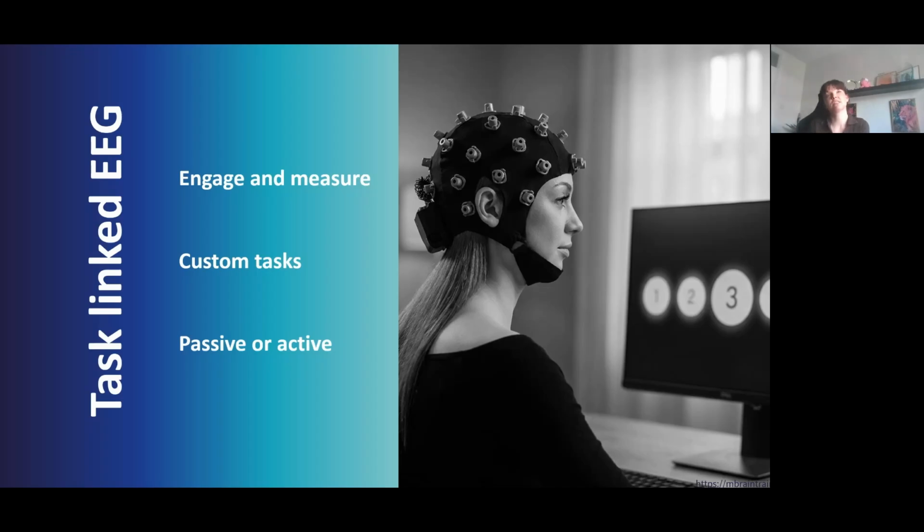In fact, there is a lot of evidence to indicate that even if somebody is able to do a task normally, or apparently normally based on their performance measures, you can still detect abnormalities in how their brain is functioning. For example, even if somebody is able to do a task just as well as a control population, their brain may be compensating by using different networks in lieu of some less functional networks. And this is particularly powerful if you want a sensitive measure of how your drug is not just improving task function, but is able to target the underpinning biology that's affected by the condition you're aiming to treat.